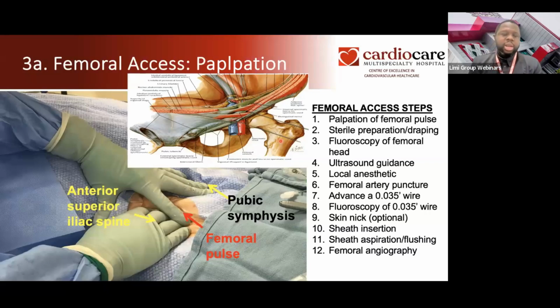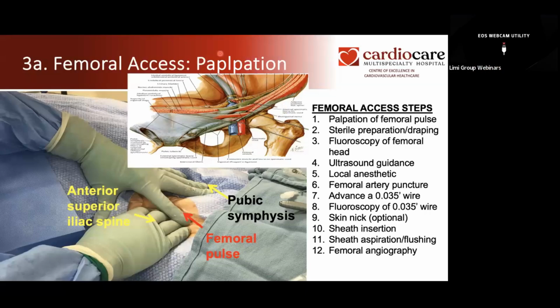If you are using femoral, that is. Now if you are using radial, you typically will have to give heparin because the vessels are smaller and the tendency to clot is very high. However, if you're just doing coronary angio using femoral, you probably will not use heparin unless you want to stent. So typically we just make sure that all your saline is heparinized, a very small amount of heparin in the saline that you use to flush. But apart from that, we do not actively give heparin. We typically give heparin only when we want to deploy a stent, when we have seen a blockage and want to start intervening in the coronary vessels. But if we are using radial, we typically will give about 5,000 units as we are doing that.